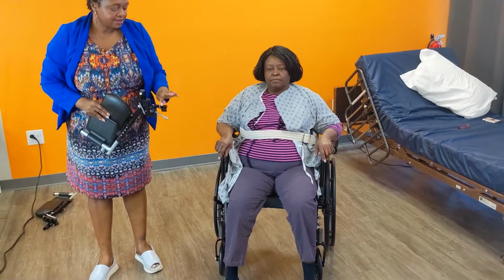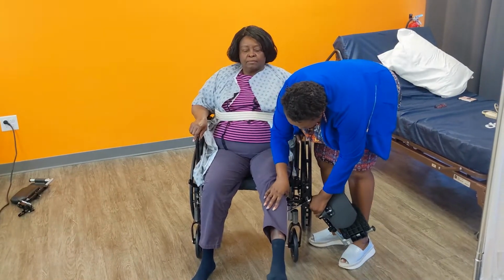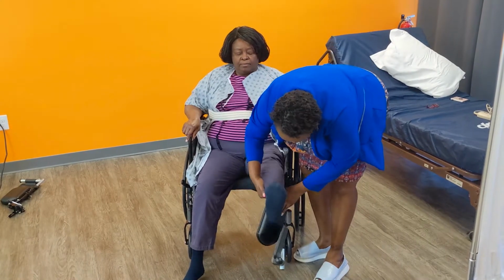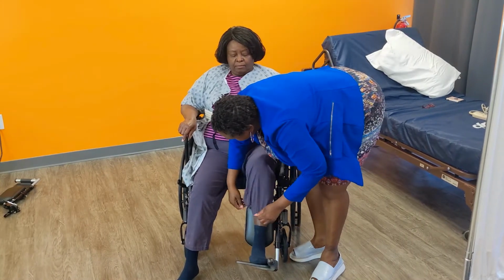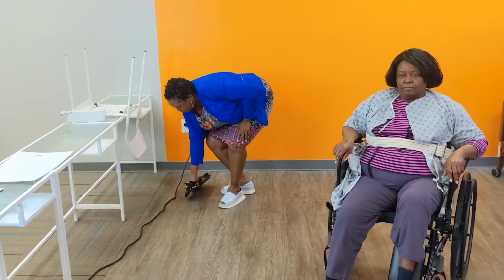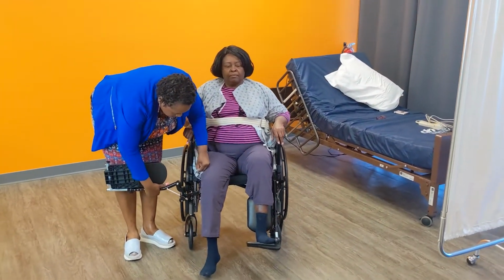So you have to look at this. This goes on the inside. So I think this is on this side here. Sometimes the footrests get a little tricky. So again, go back and watch my footrest video. When you're putting the footrest back on, be very gentle with your patient. Make sure it locks into place because you don't want it to hit the patient or scratch the patient, okay? And working with the wheelchair just takes some practice.